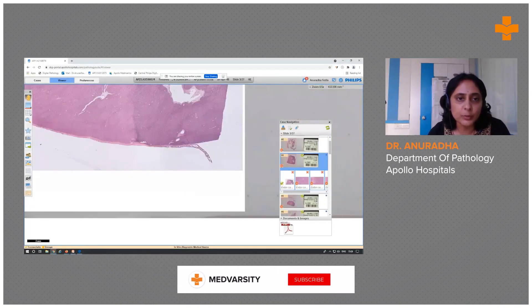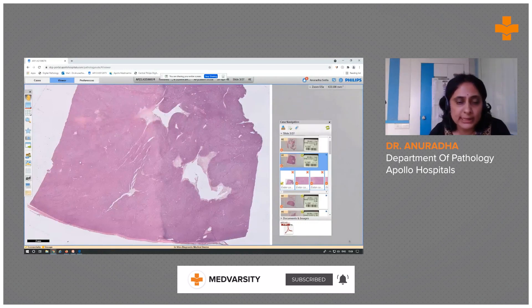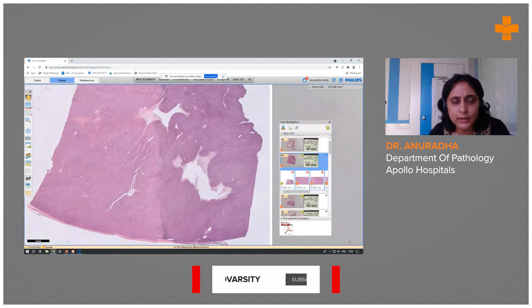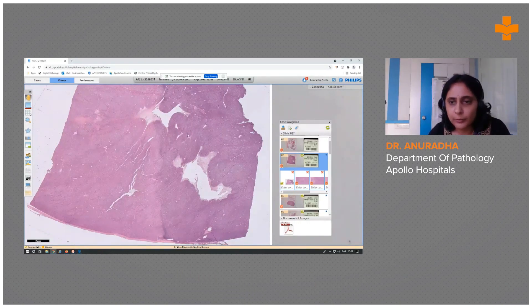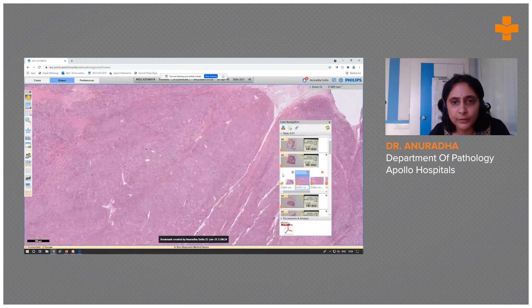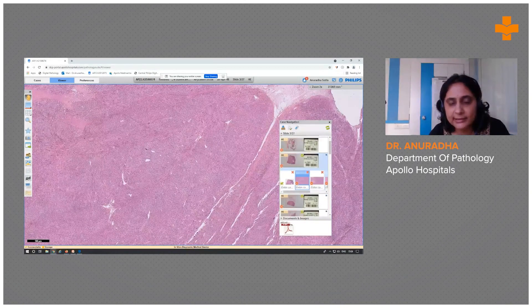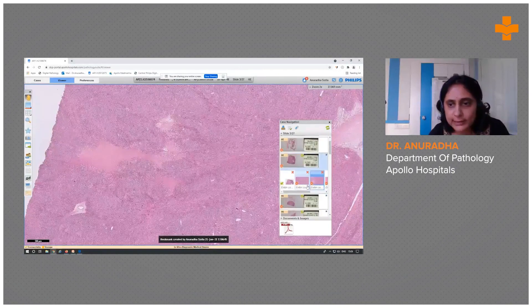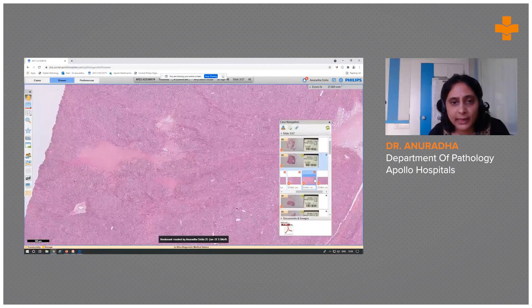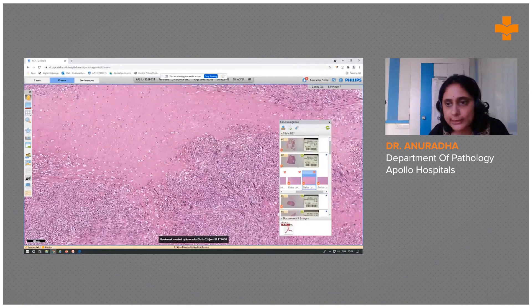Shifting to digital pathology — these are the microscopic sections. On low power view, it is a very highly cellular tumor with a lot of blue appearance. On closer view, the tumor cells are arranged in fascicles with a few foci of necrosis.